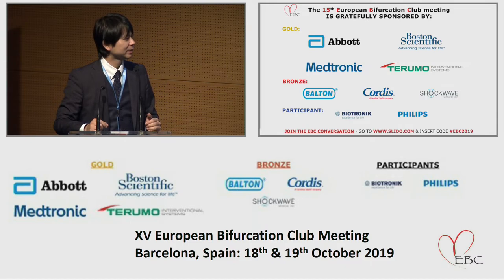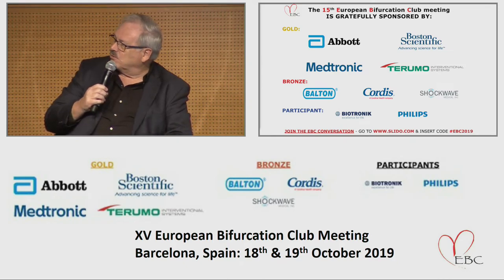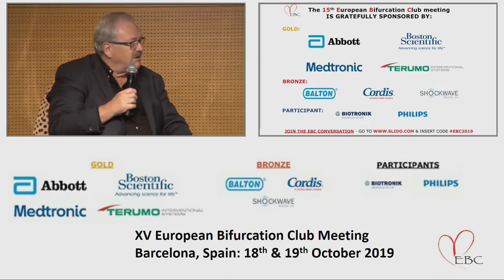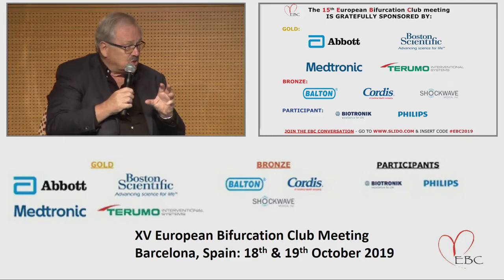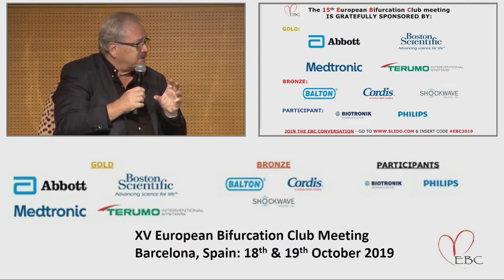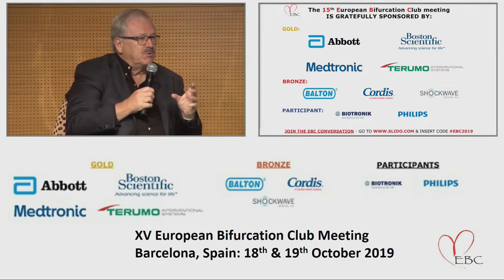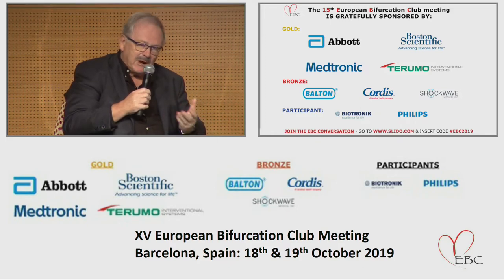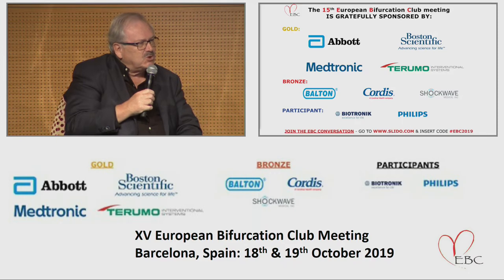I think that one basic remark that we have to make, I remember when Takayuki Okamura in our lab showed the first pictures, I was really impressed by what has been achieved. But obviously, each stent platform requires a different strategy. That's the first point. So you have to individualize your approach of the cell with the guide wire according to the shape and the platform of the stent. And that's a major challenge.